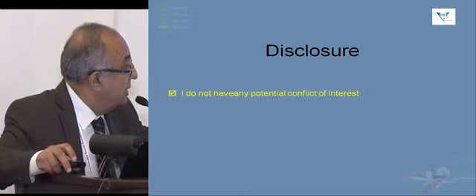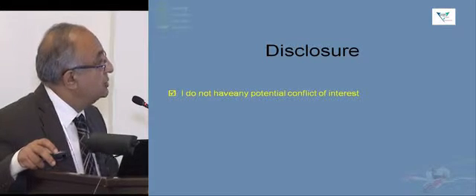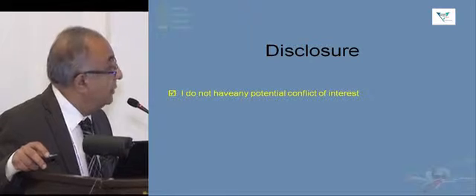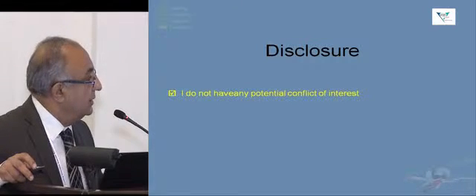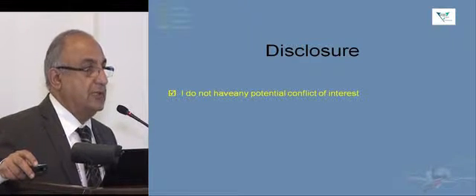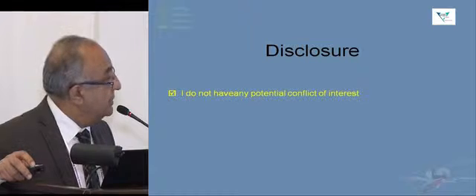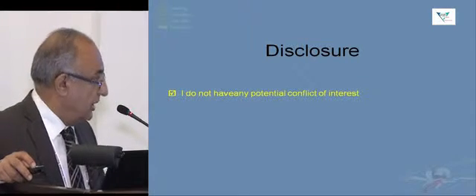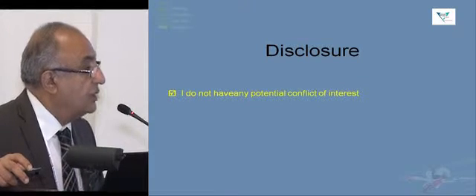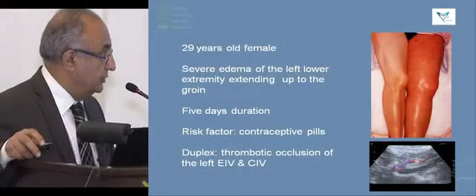The thrombus was crossed with the catheter, and this image shows a patent inferior vena cava. Then she had a thrombolytic catheter placed into the external iliac vein, and she underwent thrombolytic therapy. She was followed up by ultrasound until the thrombus was completely lysed. And this is the completion image, which shows total lysis of the thrombus, but it also shows lots of collaterals. And those collaterals indicate the presence of a chronic lesion with the acute lesion on top.